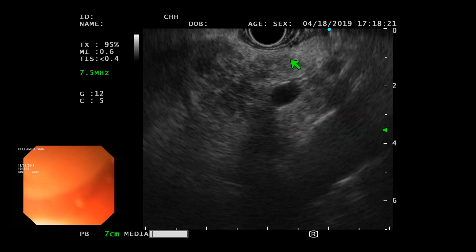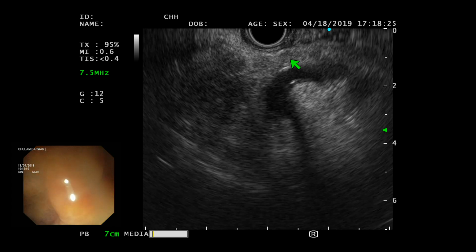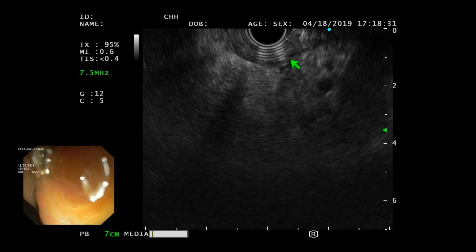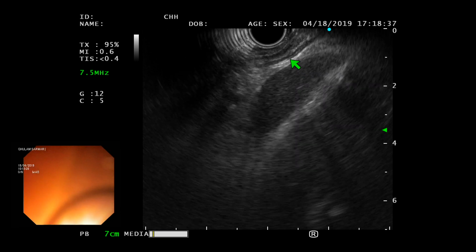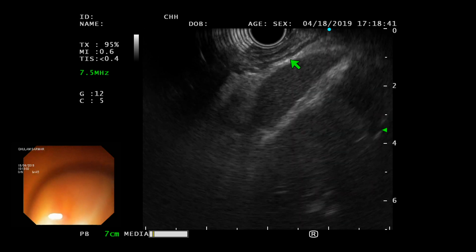So one more time, you show them endoscopically, come back. Okay, come back endoscopically. So he's coming back and looking at the endoscope. Keep coming back. Keep coming back. Keep coming. Yeah, you are at the G junction. Good job.